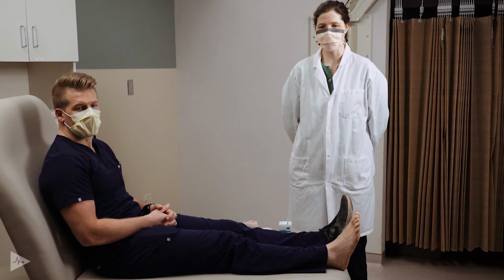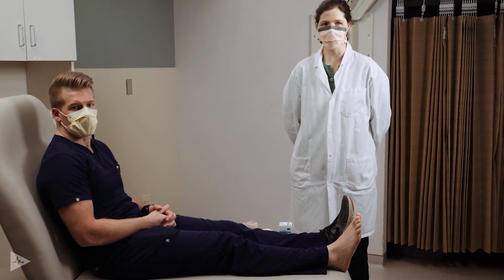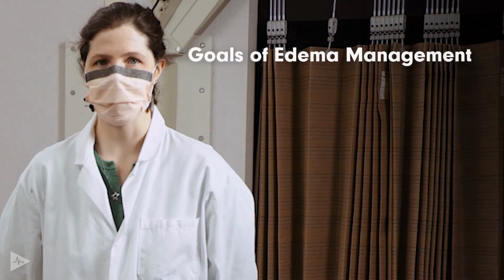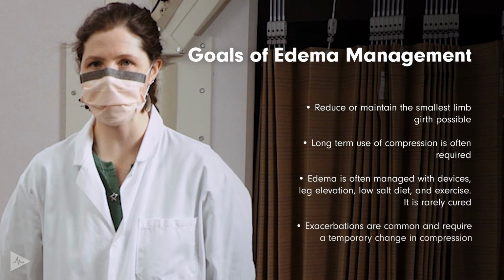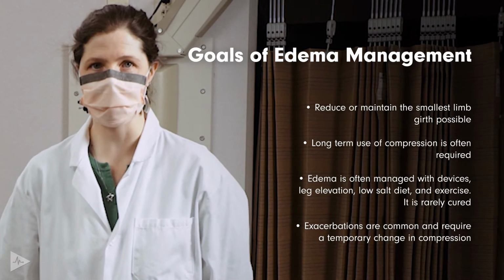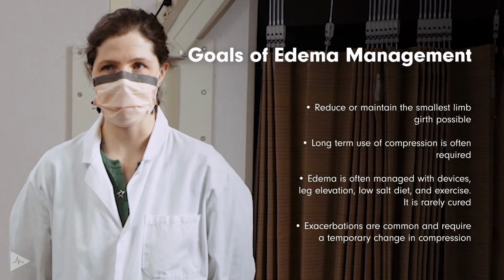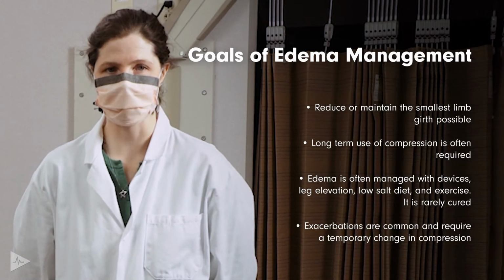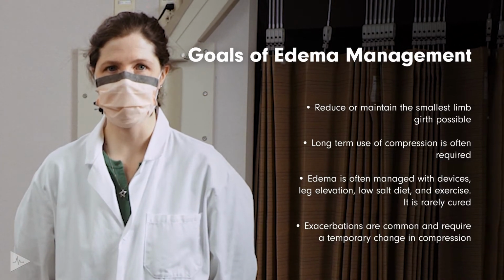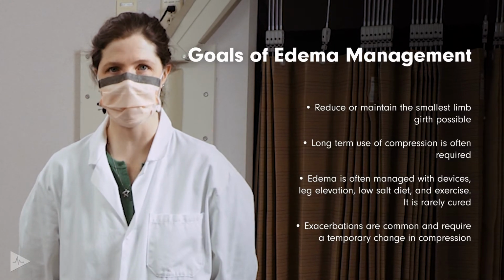There's a multitude of different types of compression, and for this demonstration, we will show how to use low stretch wraps and ACE wraps. The various goals of edema management. This is helping to heal with ulcerations, reducing the risk of cellulitis associated with edema, and managing patients' quality of life and limb girth.